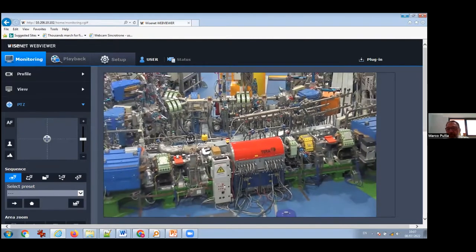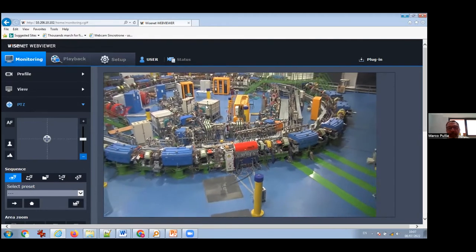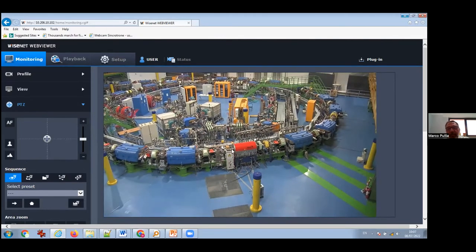This is a non-dispersive region in our accelerator. Then we have a symmetry along this axis, one period and another period on the left in our synchrotron. These two sections, 1 and 2, are dispersion free, and here we have two dispersion bumps.